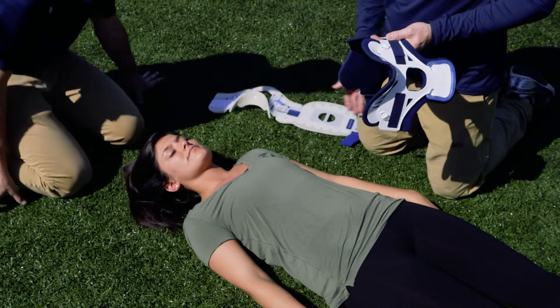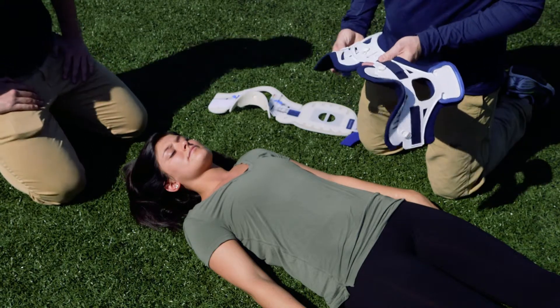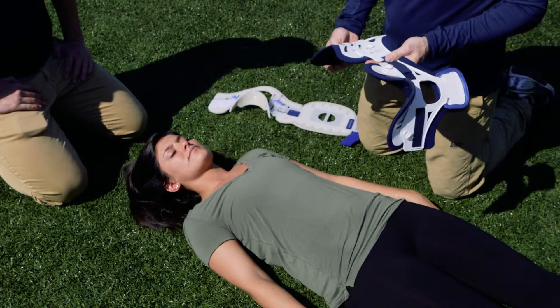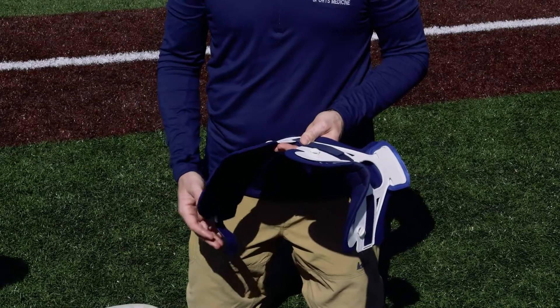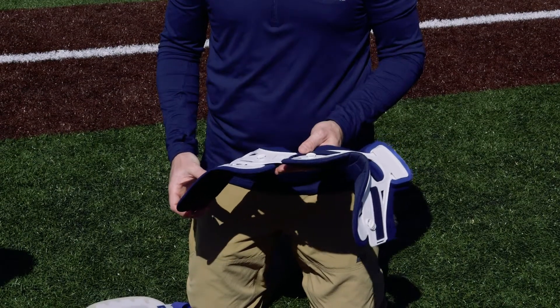In this particular situation we have an athlete that we suspect has a spinal cord issue, spinal fracture, or dislocation. What we're going to do is apply a C-collar, which is going to allow us to more safely transport this individual to the emergency room via an ambulance.